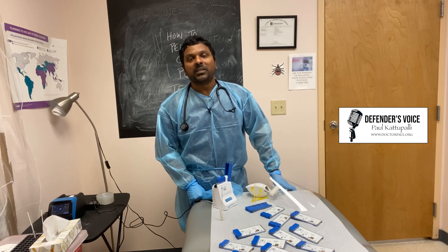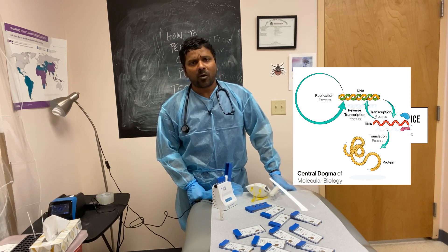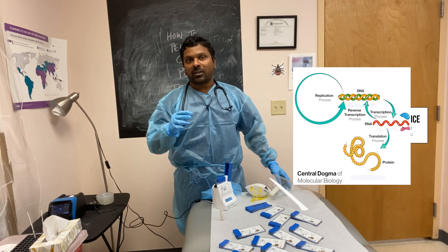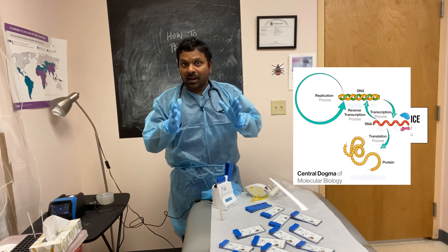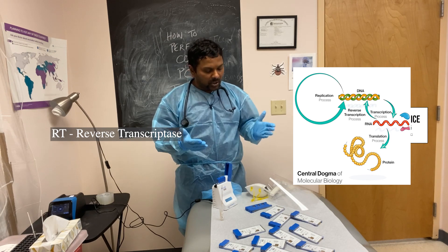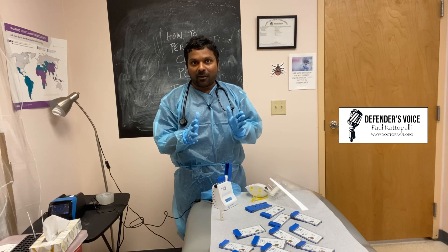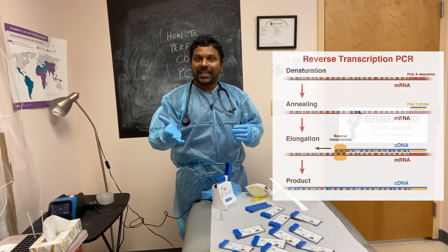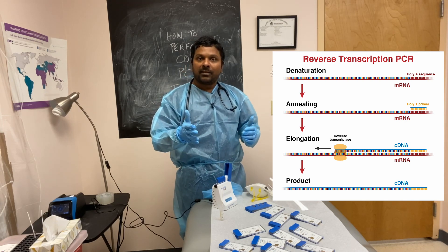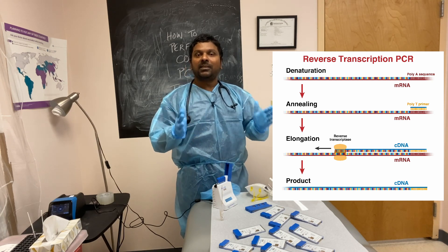PCR stands for polymerase chain reaction. You take the RNA of this virus using an enzyme called RNA-dependent DNA polymerase and convert this RNA into DNA. The RNA-dependent DNA polymerase is also called reverse transcriptase — that is why this test is called the RT-PCR test. You take RNA from the COVID virus, convert it into DNA using reverse transcriptase, and then amplify the DNA millions of times to detect the virus.